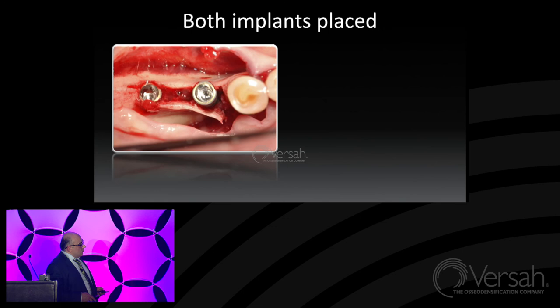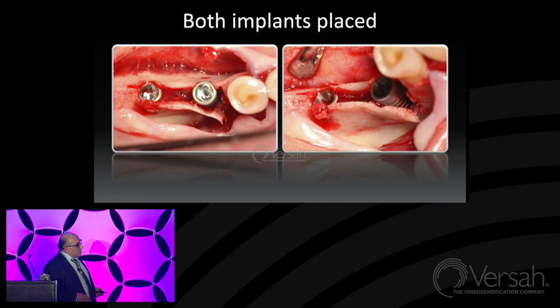And the second one, look at this. We have so much elasticity of the bone, and we're able to manage the situation. Look at this, it's really amazing. It shows how elastic bone may be. The only condition of this whole procedure is not to be in a hurry. We have to take the time for the bone to make some elastic deformation.